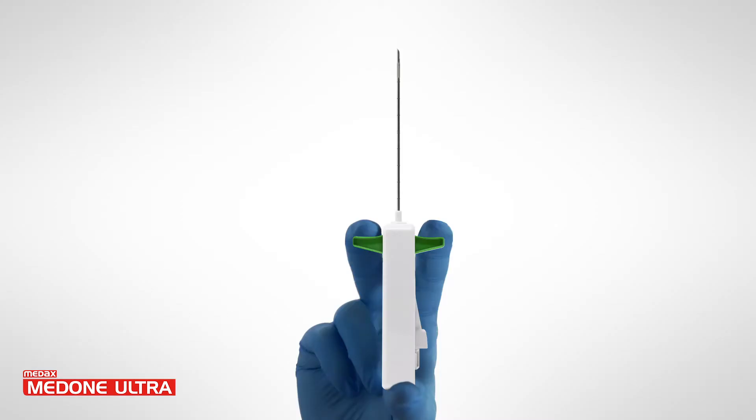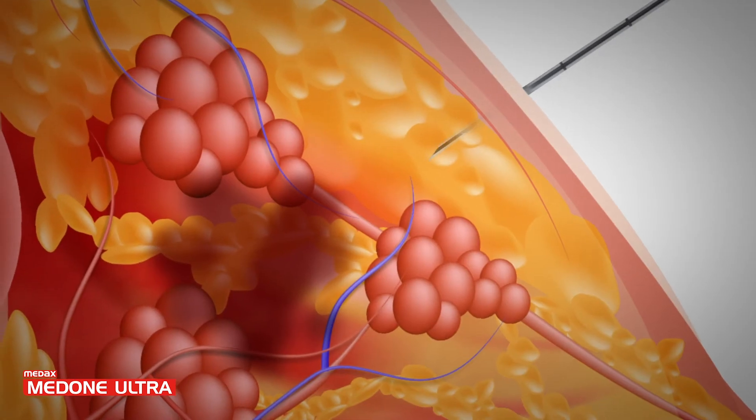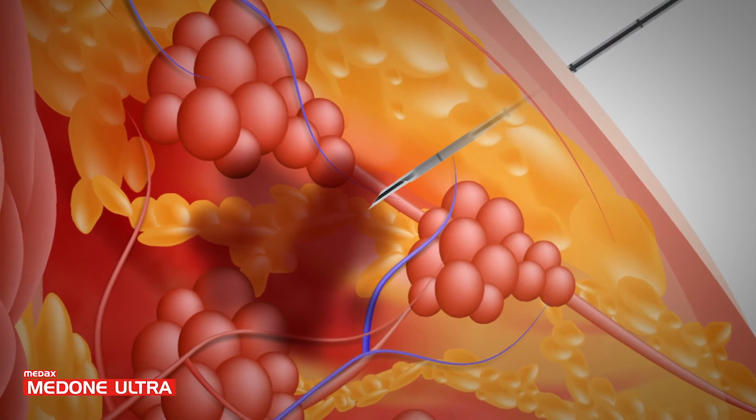MedOneUltra is now ready to operate. Pull back the loading levers twice: first to load the cutting cannula and second to load the stylet. Place the needle tip at or near the lesion to be biopsied.